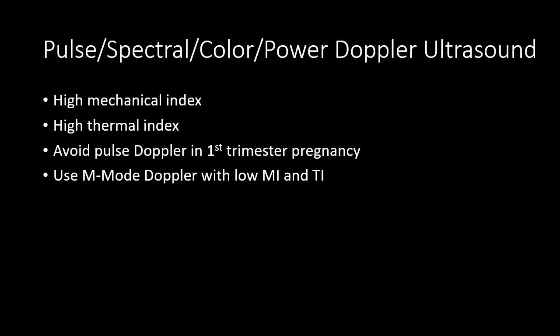It's important to remember that all forms of Doppler imaging have a higher mechanical index than the forms of grayscale imaging. They also have a higher thermal index. Because of the high mechanical index and thermal index of Doppler ultrasound, we avoid using Doppler in the first trimester of pregnancy due to potential risks for cavitation within the very small developing and delicate fetus.